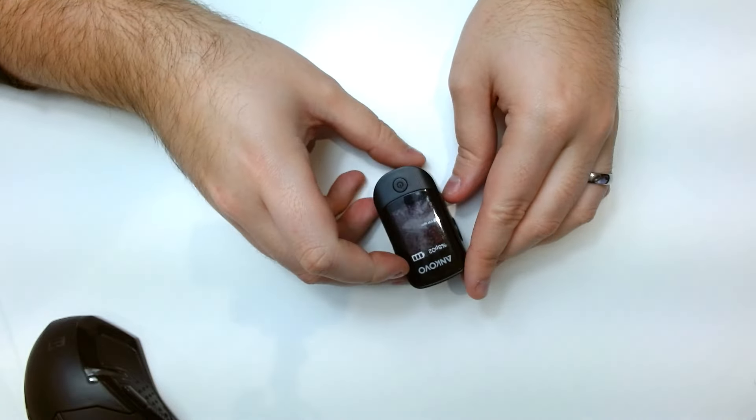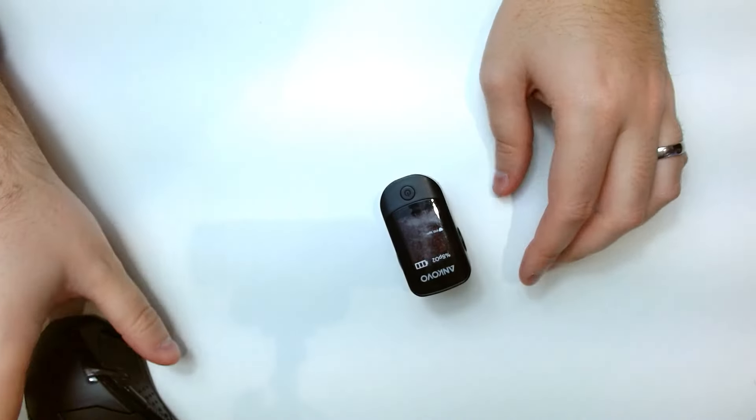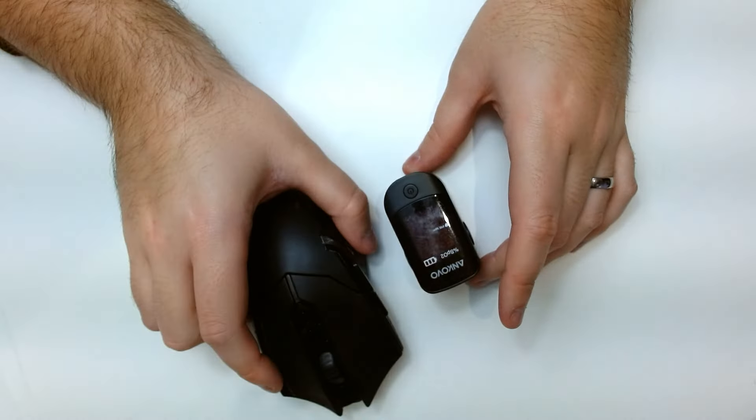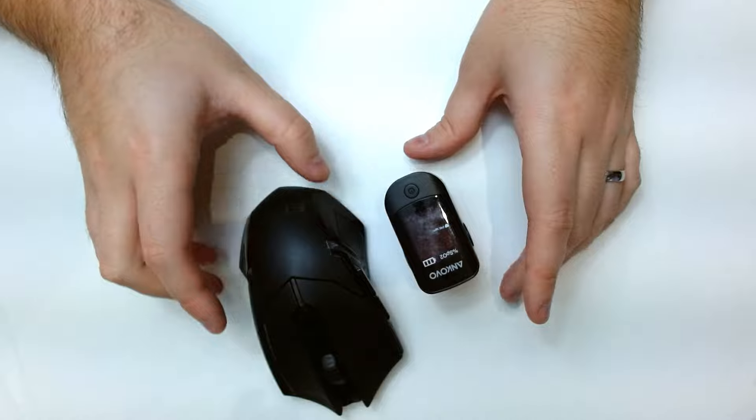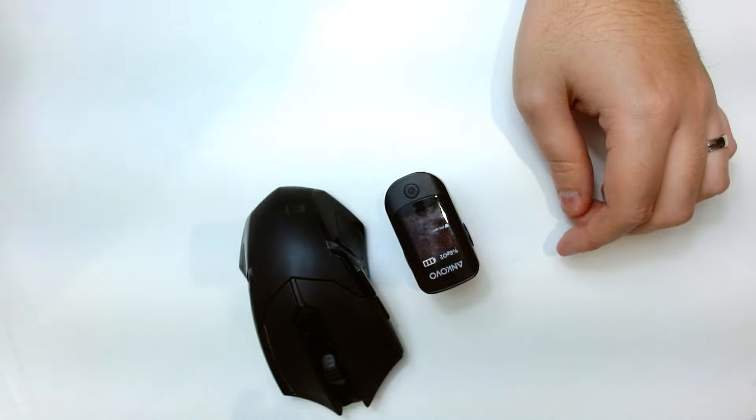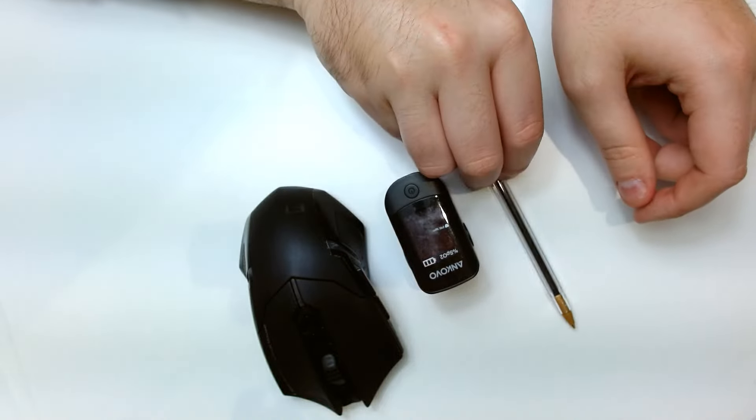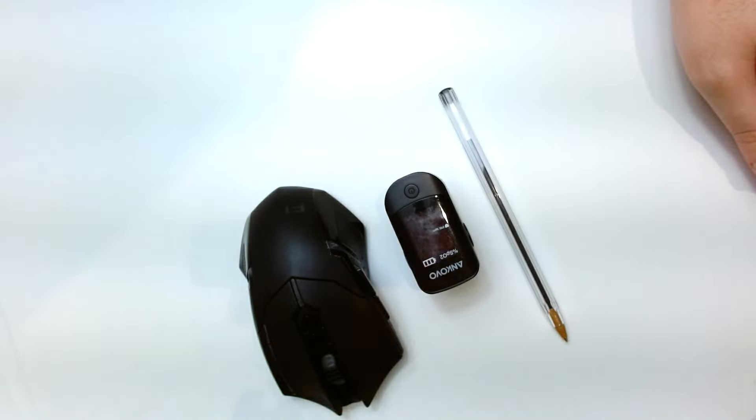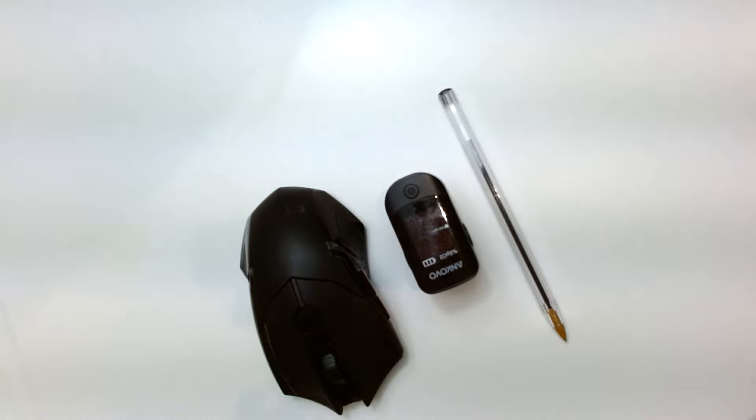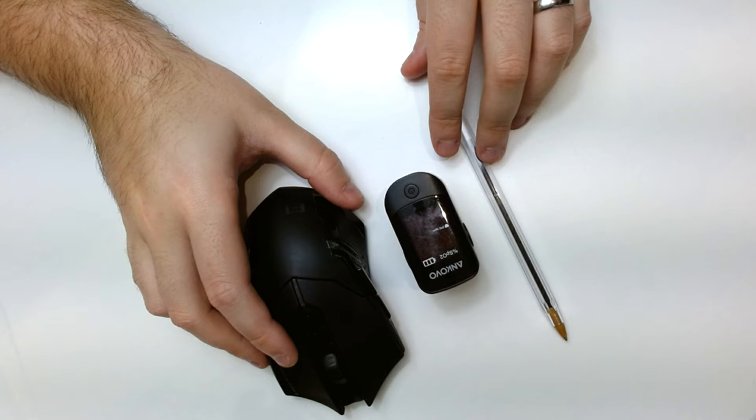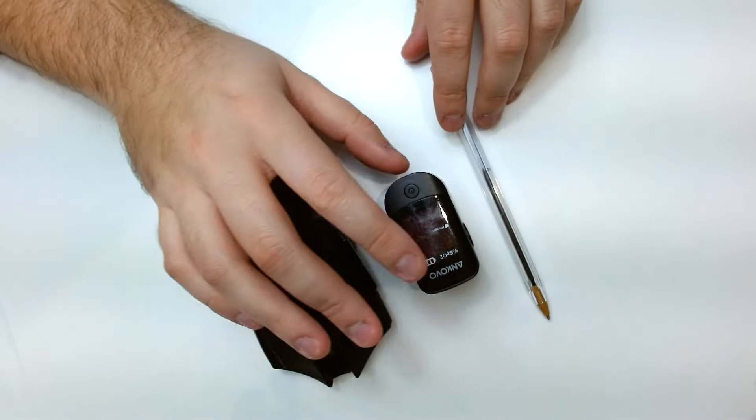To give you an idea of size, I'll compare it next to my mouse or I've got a pen here as well so you can compare it.